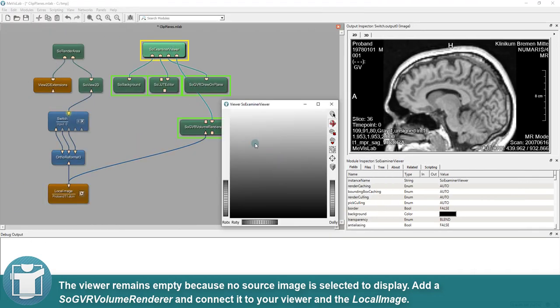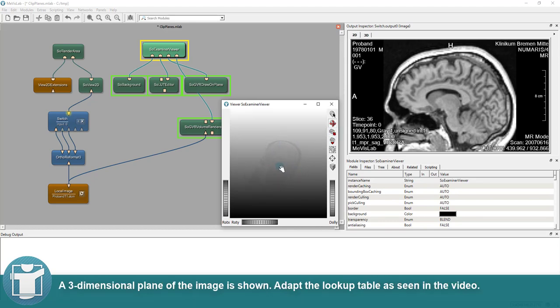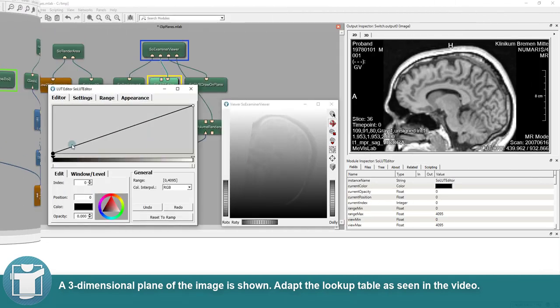Add a SO GVR Volume Renderer and connect it to your viewer and the local image. A three-dimensional plane of the image is shown. Adapt the lookup table as seen in the video.